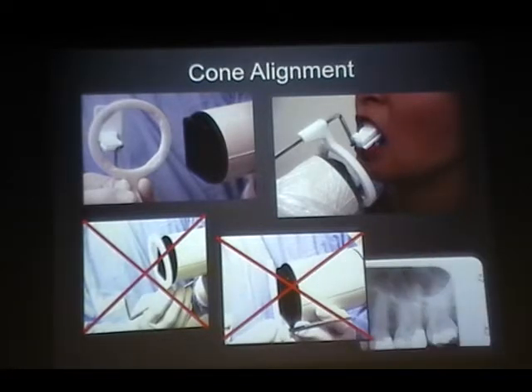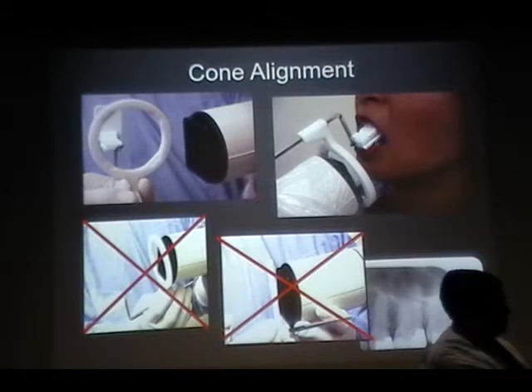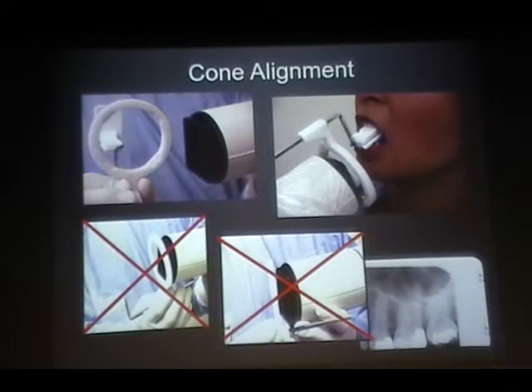So basically, what is happening here in this case is, imagine these are the full set of teeth, right? So the receptor should capture, and the X-ray should come, we can capture the whole set. What if the collimator is like this? So you are losing that white space, and it's not helpful for us. So please make sure that it is covering the teeth. Otherwise, you're going to miss a lot of information, with unnecessary radiation.